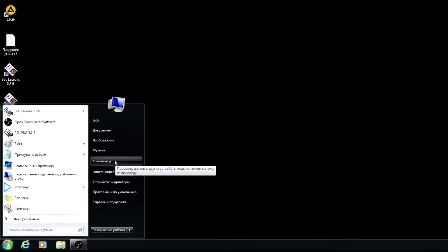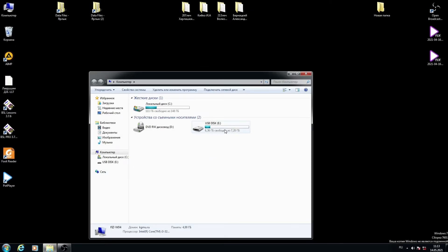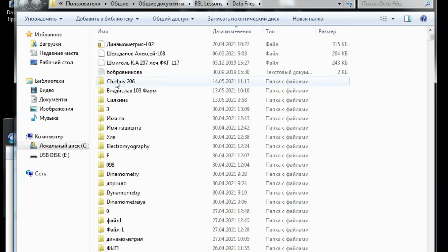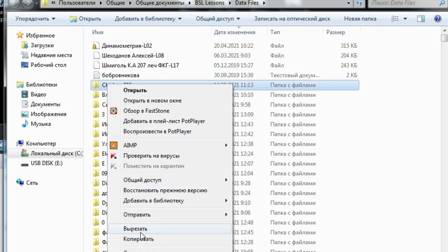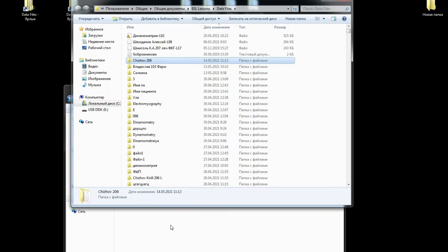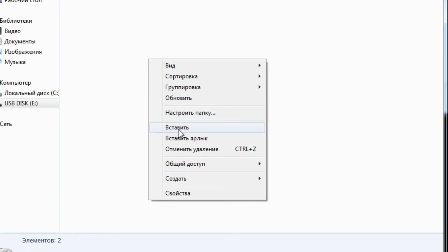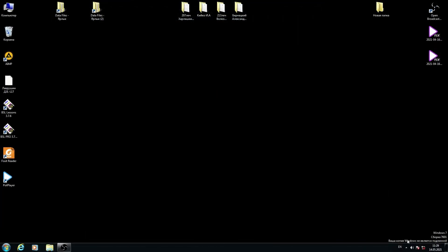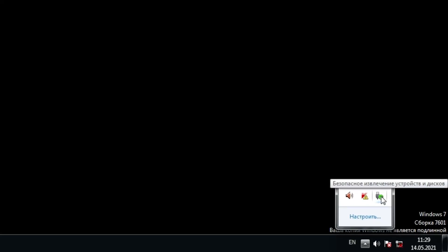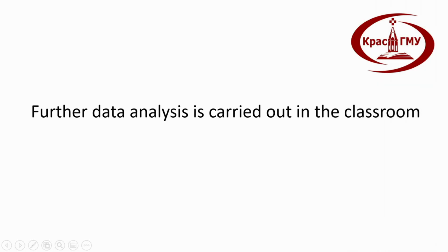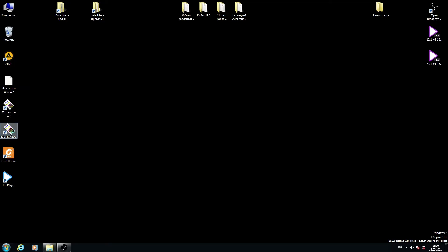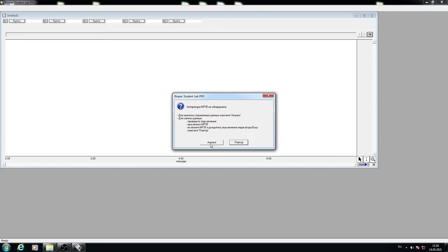Copy the file to a USB flash drive, then remove the flash drive. Further data analysis is carried out in the classroom. For data analysis, open Review Saved Data and select the correct file.